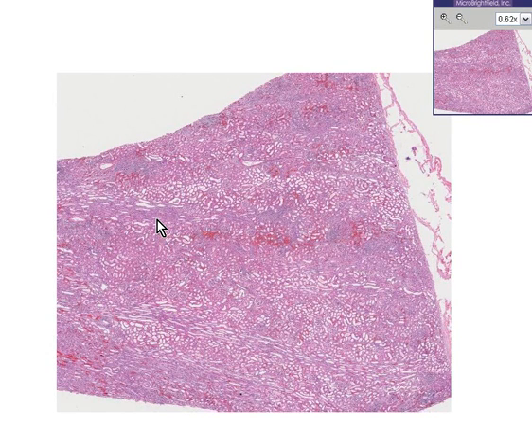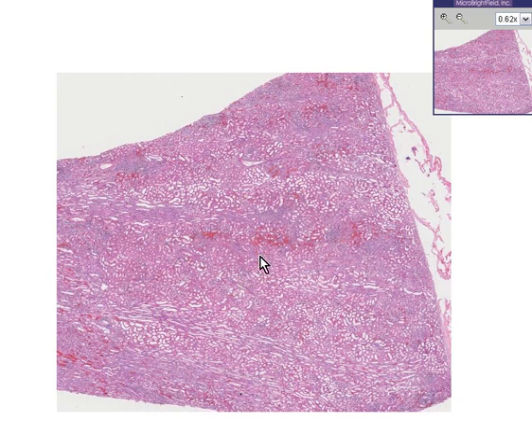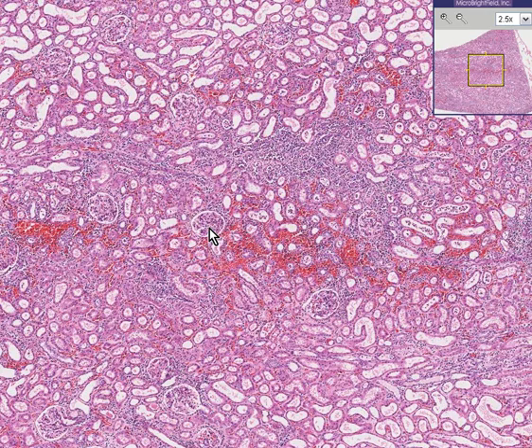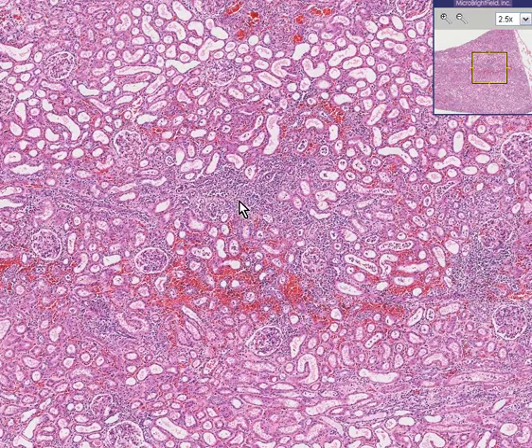The term interstitial nephritis refers to inflammation of the kidney, either acute or chronic, as represented by neutrophils versus lymphocytes respectively, in which the primary focus of inflammation is not in the glomeruli and not in the tubules but in the interstitium.